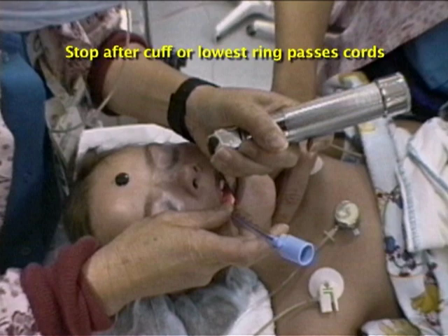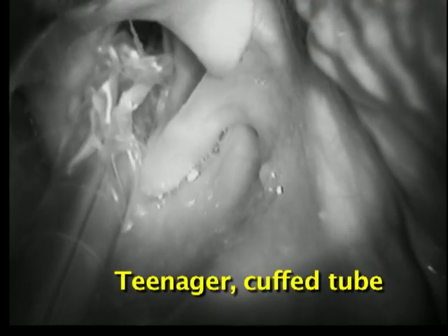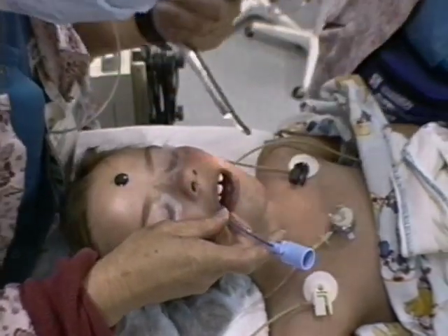Stop when you see the lowest marker ring past the cords. While there may be a blind spot at the moment of entering the larynx, you can often see the arytenoids behind the tube. Carefully remove your laryngoscope blade.